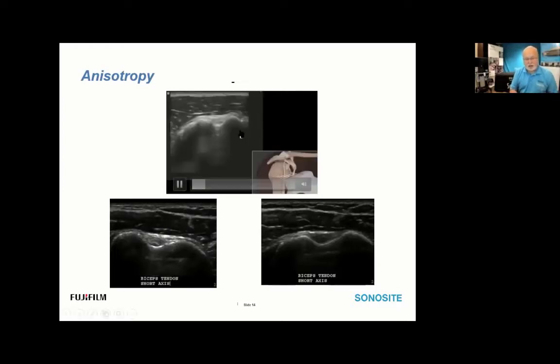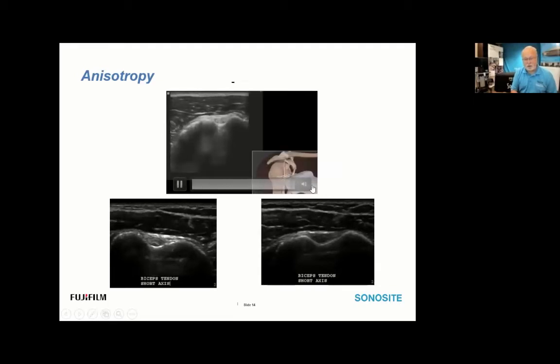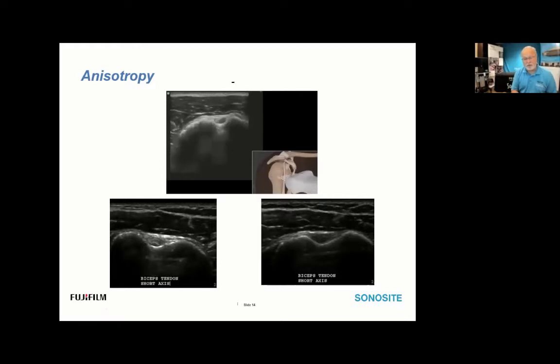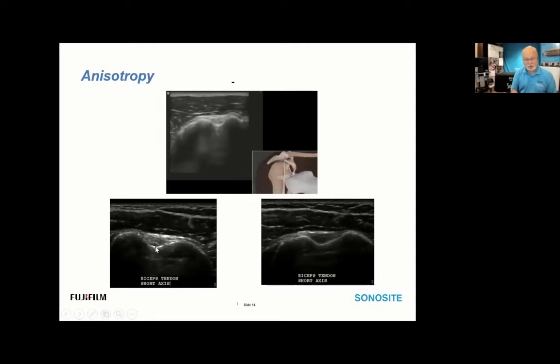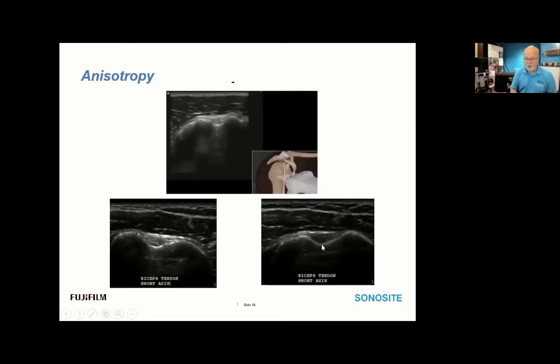An example of anisotropy: in this short axis view of the bicep tendon, notice the transducer angling back and forth. When it's brightened, the transducer is perpendicular to the tendon. When off-perpendicular, you get echo dropout and an echo-poor appearance of the bicep tendon. Here we see a still image comparing an appropriate incident sound beam angle versus an off-perpendicular one, with anisotropy present as a result.